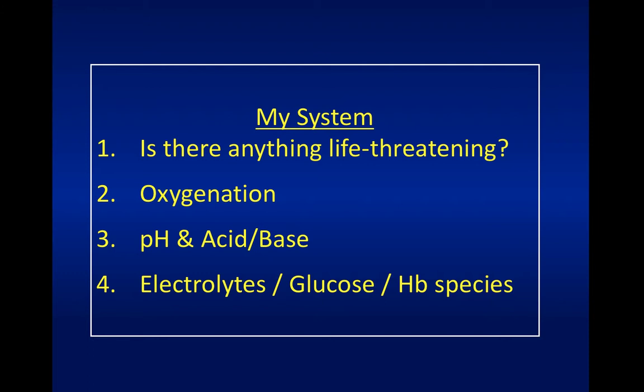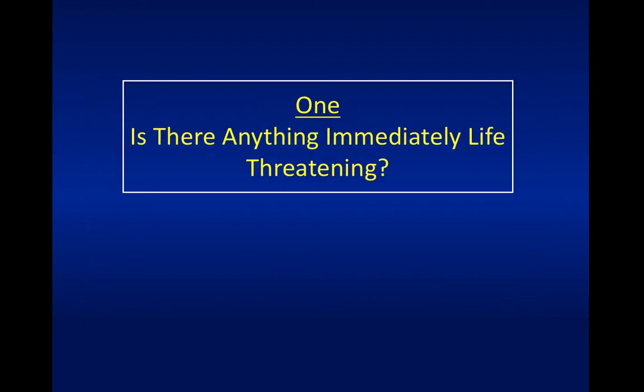So, but the patient can't be well, or must be in a critical situation usually, and then it's from there: oxygenation, pH, acid base, and then the other information on the blood gas. All right, so let's have a look. So is there anything immediately life-threatening?